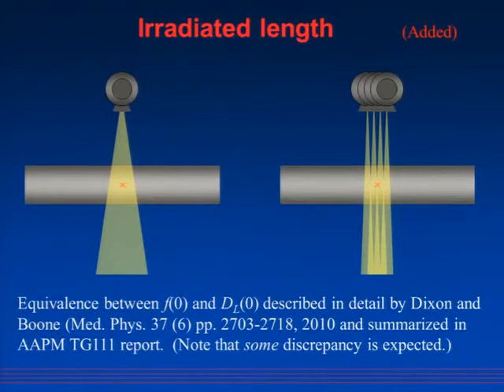The idea that, well, how do you apply that when CTDI has been invented for a moving table in a scan? But it doesn't matter if the table moves or not. It just matters what the irradiation length is.